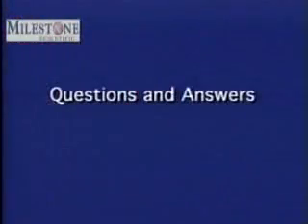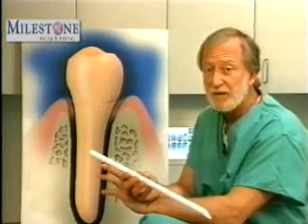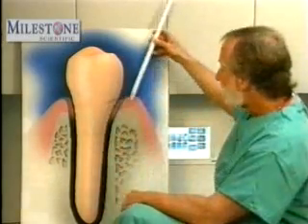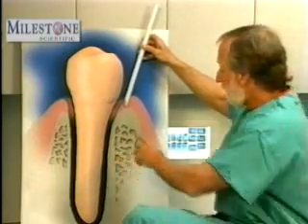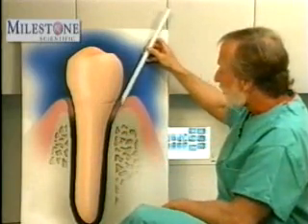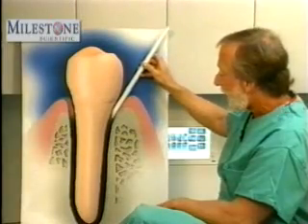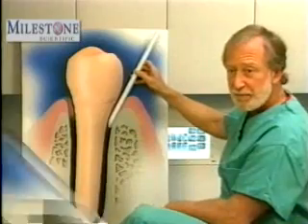Here are some frequently asked questions. My needle stops, I administer the local anesthetic, and I see blanching, but I don't get any pulpal anesthesia. What is likely happening is the needle is impinging on the crest of bone. The anesthetic then is diffusing into the buccal soft tissue. You're not getting any pulpal anesthesia. To correct this, make certain that your needle is in contact with the tooth the entire time, and this way it will advance into the periodontal ligament space.